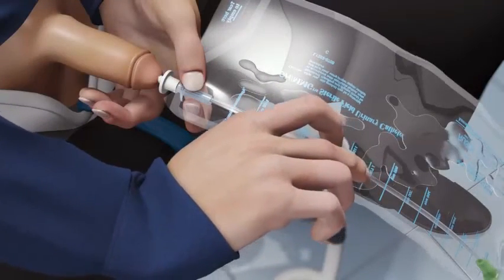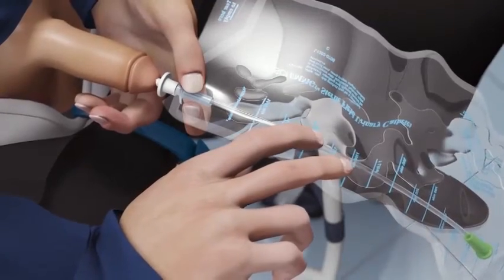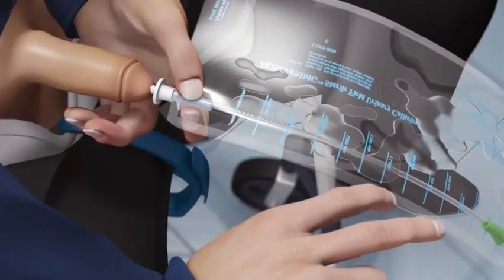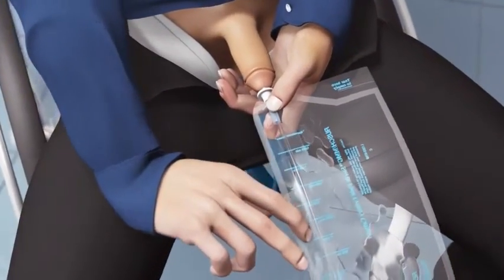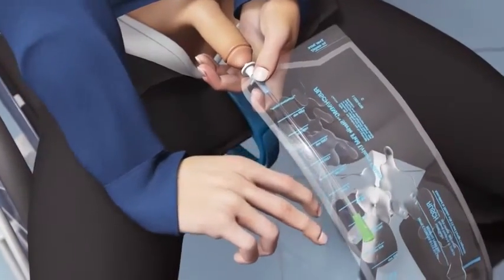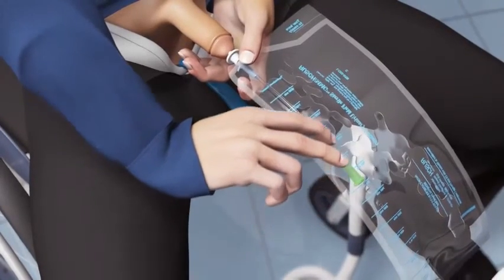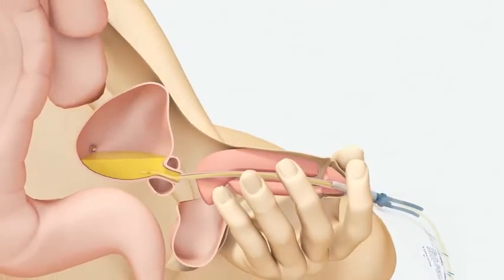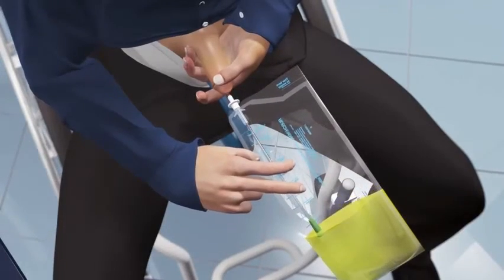Using your right hand, begin to advance the catheter into the urethra 1 to 2 inches at a time. After each push, pinch the split introducer guide to hold the catheter in place while you straighten the bag with your right hand. Continue advancing the catheter until the catheter has entered the bladder and urine begins to flow. After the urine stops flowing, gently remove the catheter with the bag attached.